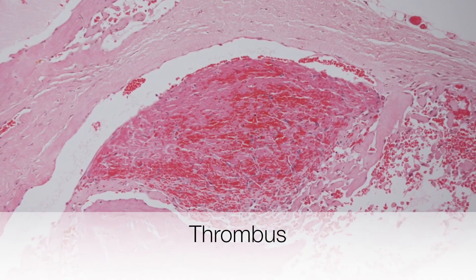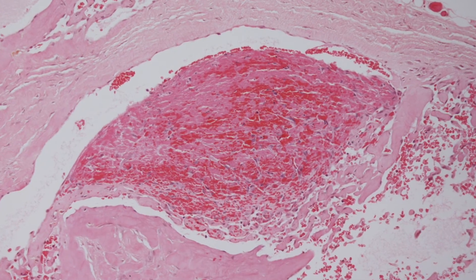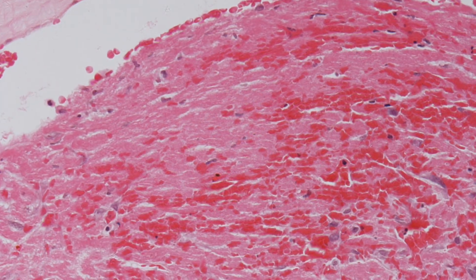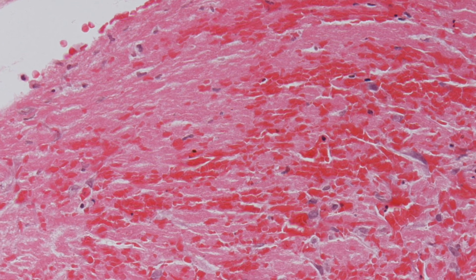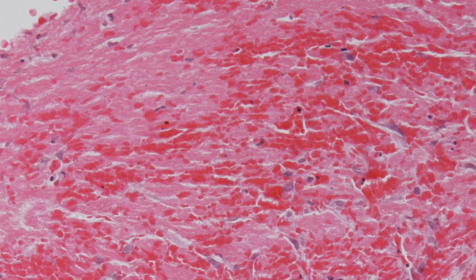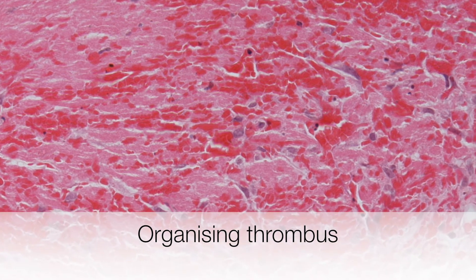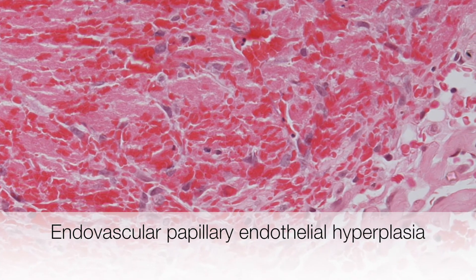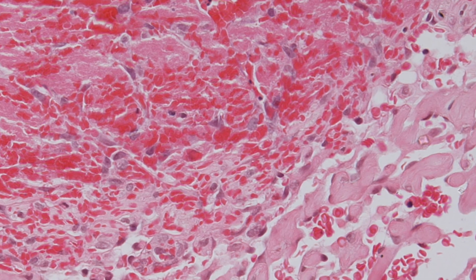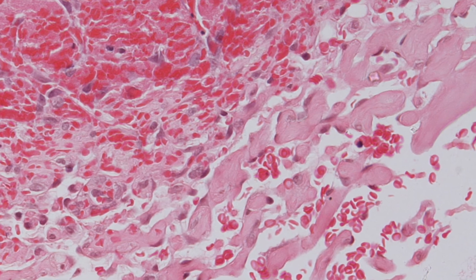In this picture, you can see papillary endothelial hyperplasia arising from a thrombus. On the left side of the picture is thrombus, and as we pan along, the thrombus is gradually organising until finally it forms these papillary hyaline structures covered by endothelium. This confirms the reactive nature of the process and that the lesion is benign.